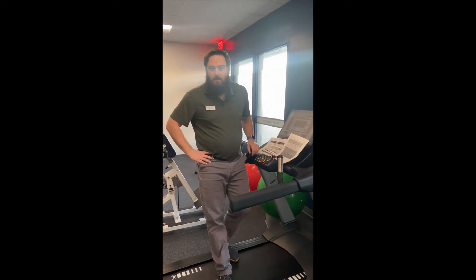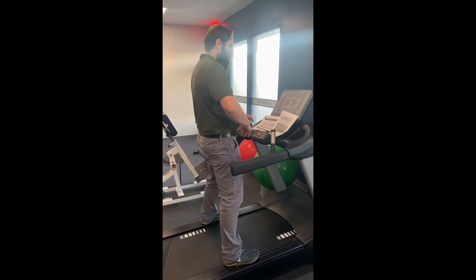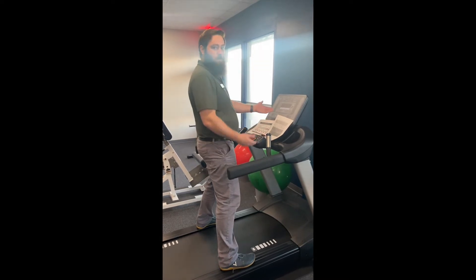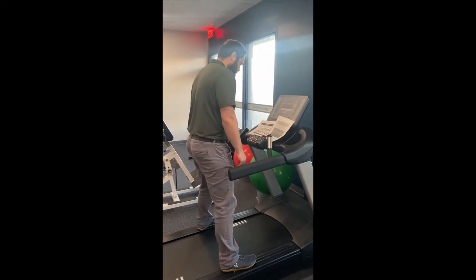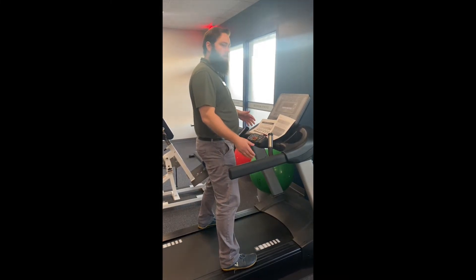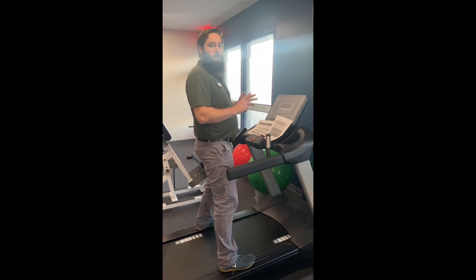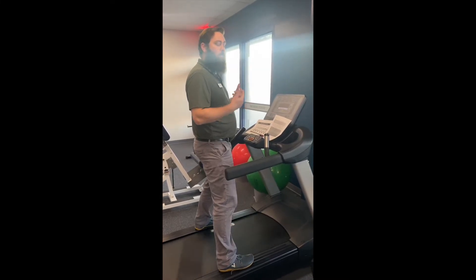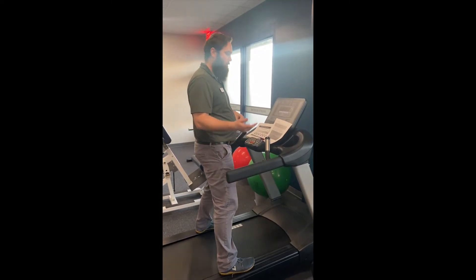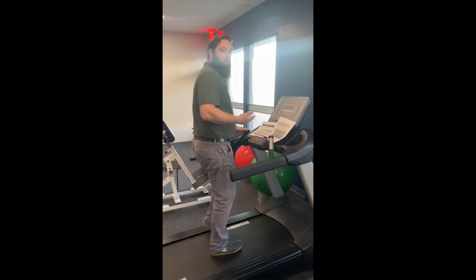To begin data collection, have the patient stand on the rails. Start the treadmill and bring it up to speed — I am 6'2", so I'll go to 3.5 miles an hour. Take your first data collection while your patient is like this. The data collection involves taking their heart rate, their RPE, and their VAS, as well as any symptoms that are present or will develop as the test goes. At the top of the minute, you can start the patient, have them start walking.